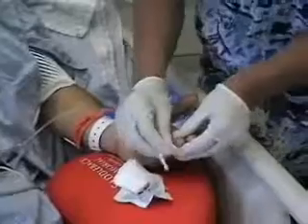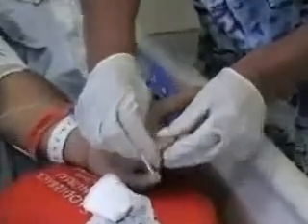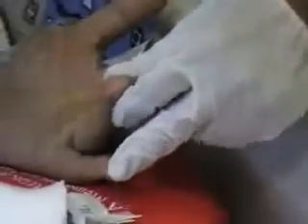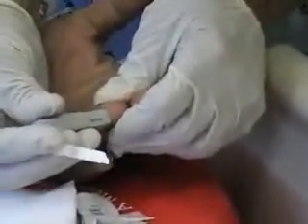Pick a finger, any finger. They say the lateral aspect of the fingers are less painful, so we'll do that. Okay — one, two, three, ouch. We're going to squeeze a little drop of blood, and then put it in a downward motion here. I always swipe just a tiny bit. There we go — that's a good drop.